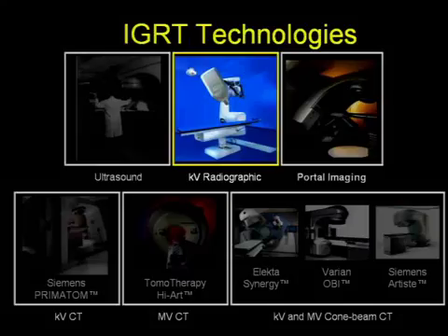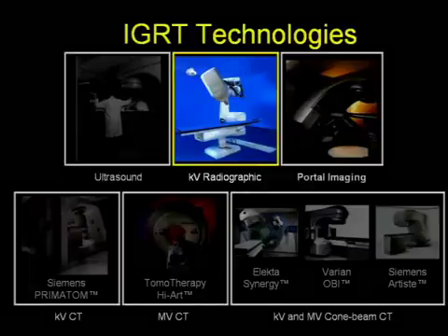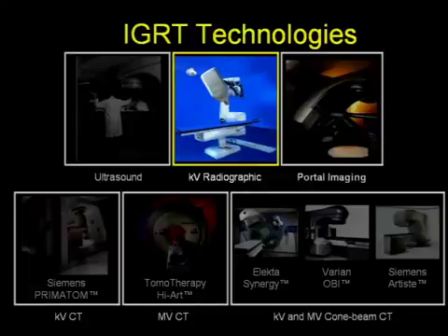The second technology that I would like to discuss is kV radiography. Some commercial vendors, such as Varian, offer the 2D perspective, and this falls into this category.